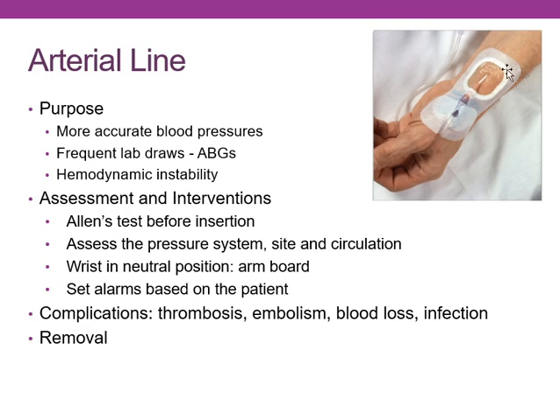But if I think there's a clot here, I don't want to flush the system. I would want to aspirate blood out. What do we do with removal? Make sure we have an order. Check to see if your patient's been on anticoagulation. If they have, you know you're going to have to hold pressure longer. The least amount of time you should think that you're going to hold pressure is for 10 minutes.